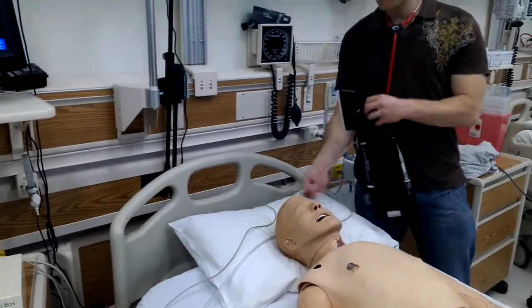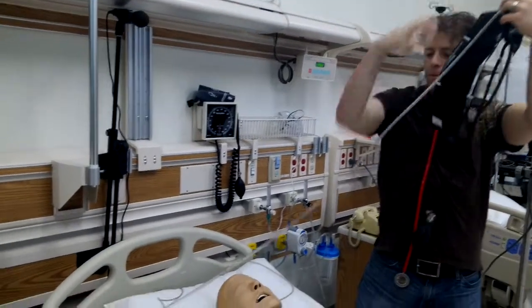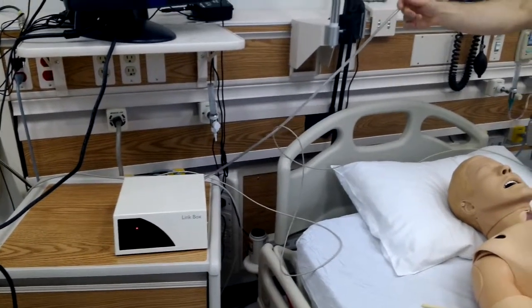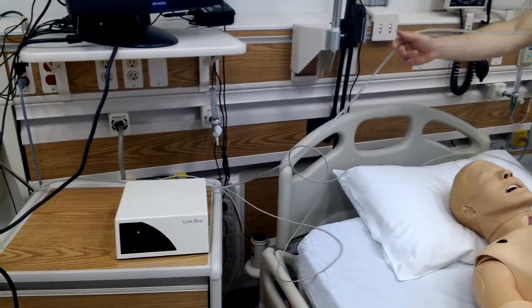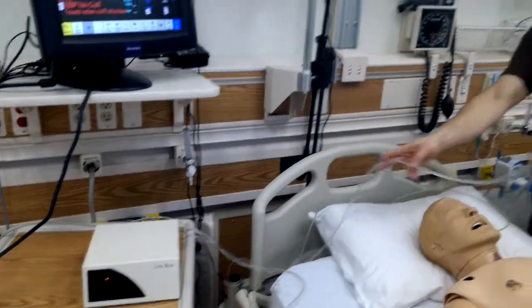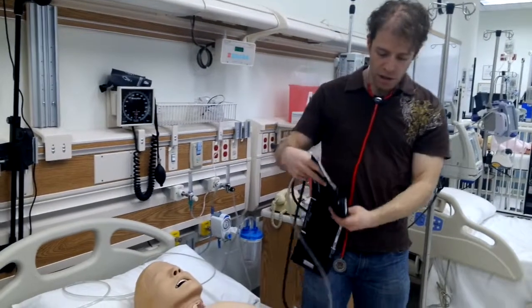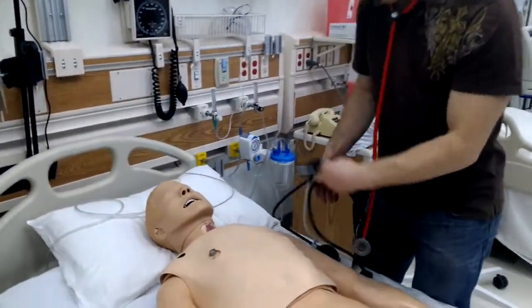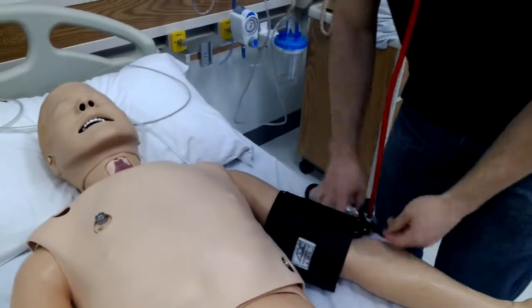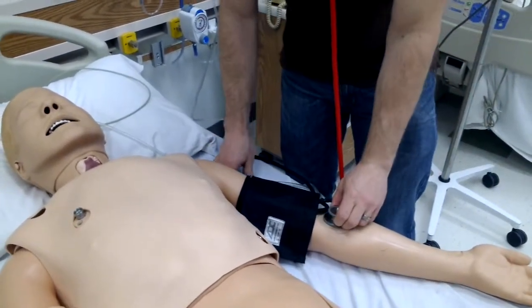Finally, blood pressure. The blood pressure cuff has a long tube — this long tube goes into the link box. For the 3G, we had a short tube going into the mannequin itself, but because all the information goes to that link box on the old Sim-man, so does this pressure tube. We put the pressure cuff on the arm, and we can plainly see where the speaker is for the Korotkoff sounds.